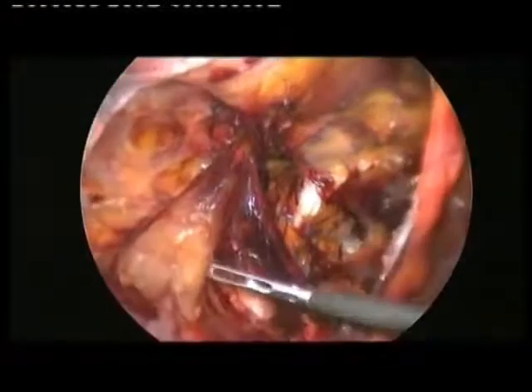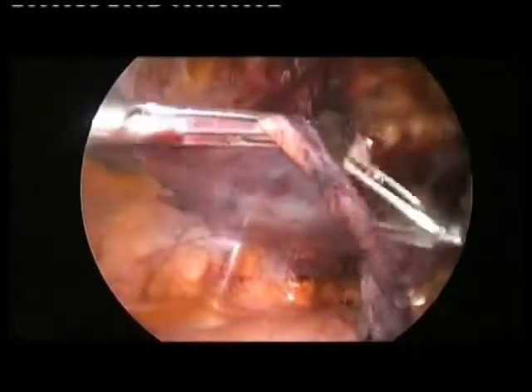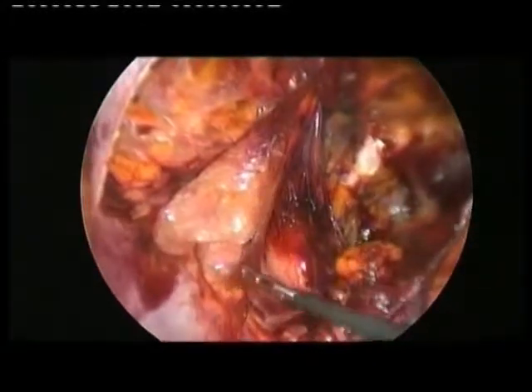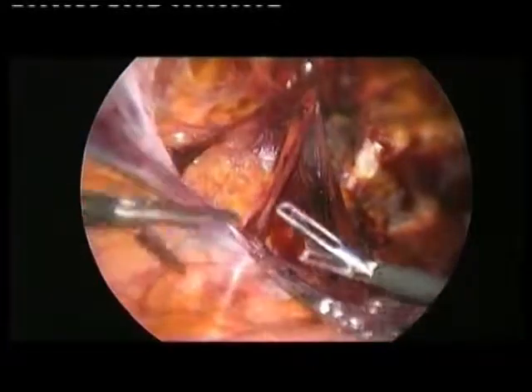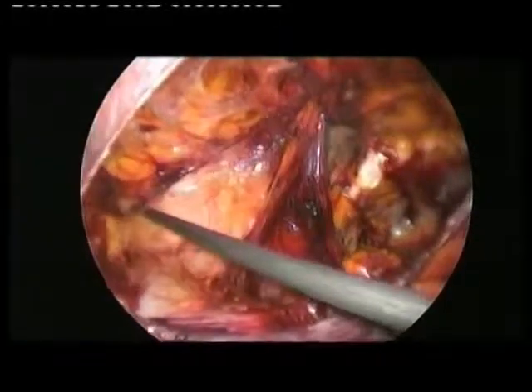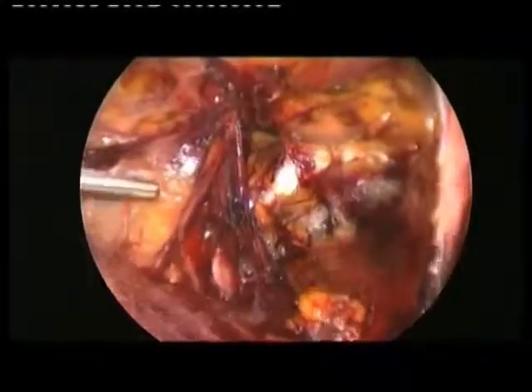So let's see the anatomy, okay? Just a second. Because I think that laparoscopic hernia repair is not indicated for all kinds of hernia, but I think that every surgeon has to know how to perform also laparoscopic hernia repair, because in some cases it's much, much better. And so let's see the anatomy.